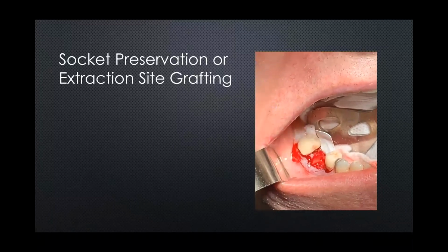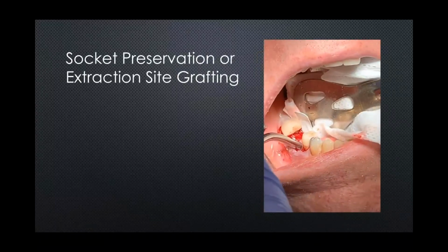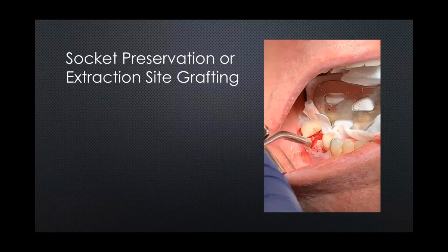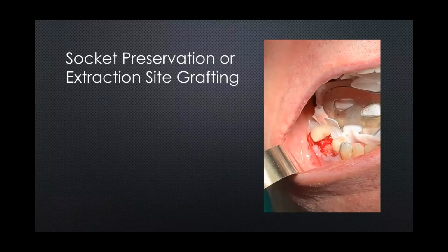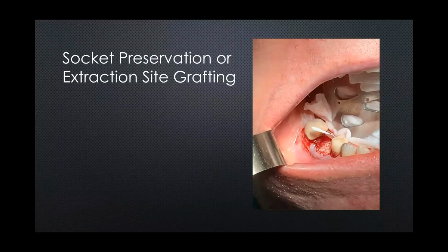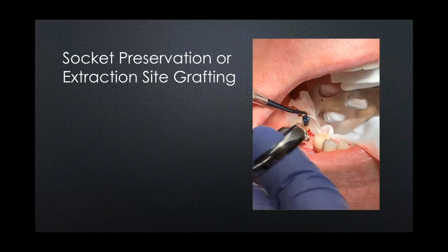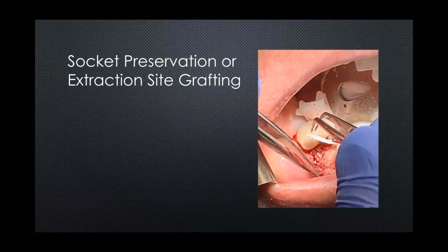And we keep doing that, and we tend to want to overbulk it, overfill it a little bit. The question then becomes, how do we tamp it down? How hard do we push down there? Well, you want to compress it so that it almost has an Italian ice type of consistency, and you're able to take your periodontal probe and gently push it through that bone. Okay, you don't want to have to force it through, and yet you also don't want it to fall through quite easily. You overbulk a little bit, and then we're going to pick up the buccal tissues.